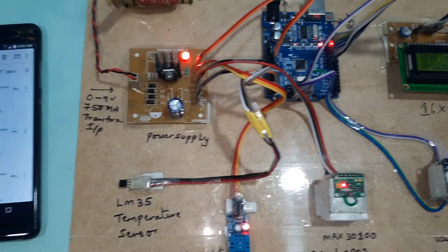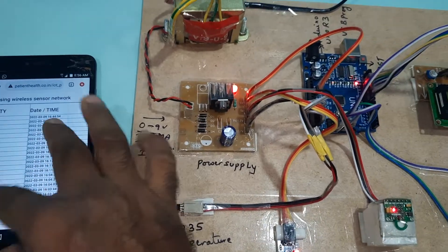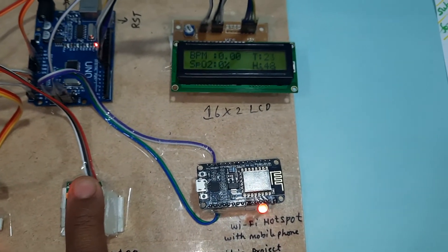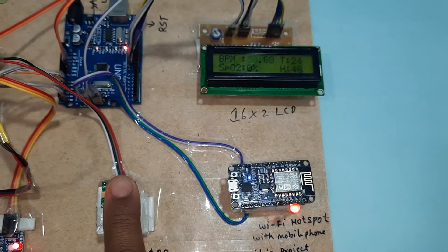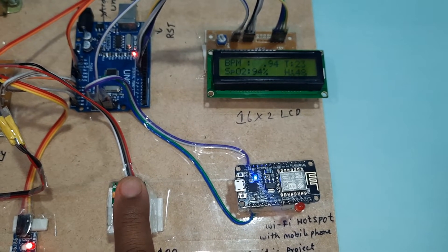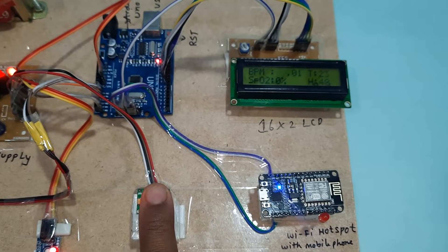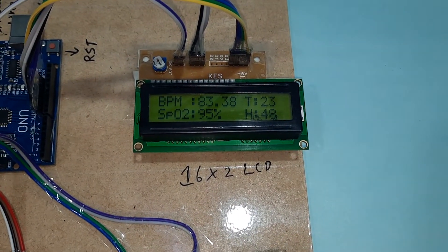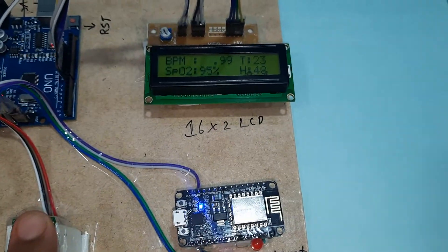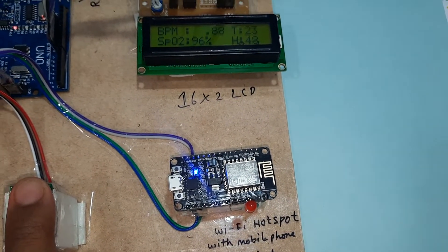Now connecting the power supply. The system shows BPM, temperature, and humidity on the LCD. After every 5th count it takes the exact value and sends the data to the server. Room temperature reads around 23-24°C and room humidity around 48%.